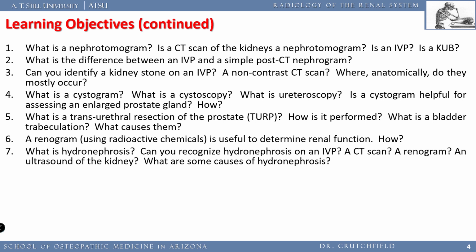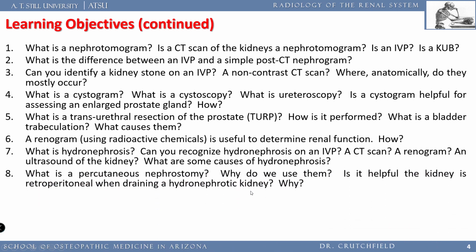What is hydronephrosis, and can you recognize it on an IVP, a CAT scan, a renogram, an ultrasound of the kidney? And what are some of the causes of hydronephrosis? As you can imagine, hydronephrosis just means a big enlarged kidney, usually because something is blocking the kidney downstream.